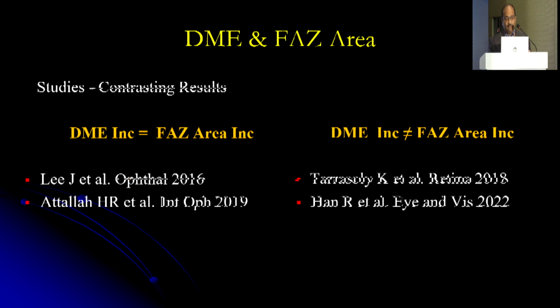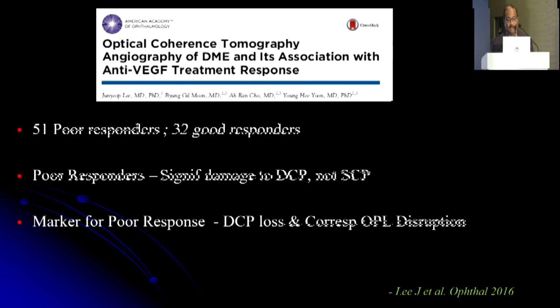Lee and Ata found that increase in diabetic macular edema corresponded well with the FAZ area increase, which Tarasoli and Han did not find in their studies. Looking at an interesting study by Lee et al., where they looked at OCT angiography in DME and its association with anti-VEGF treatment response.